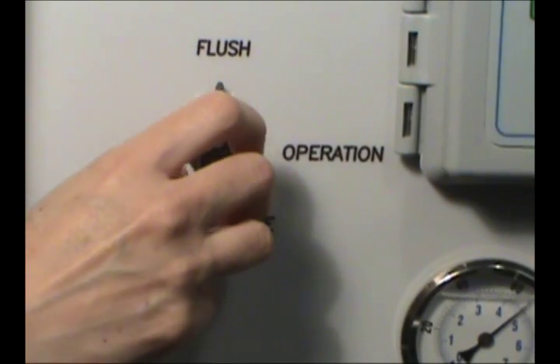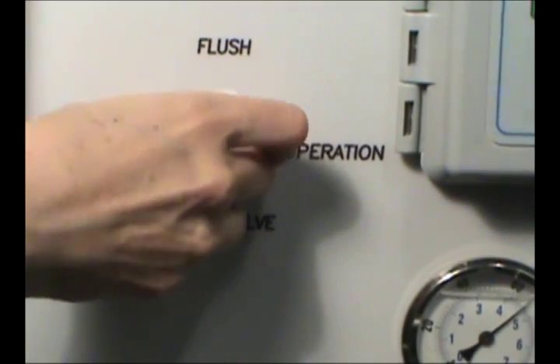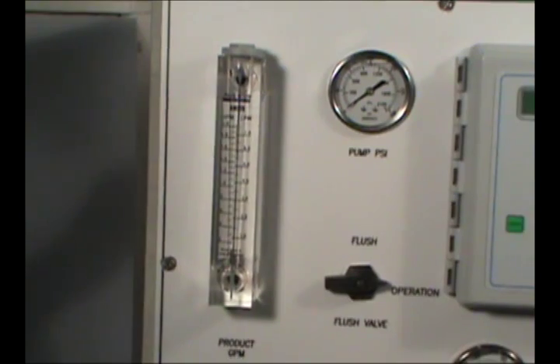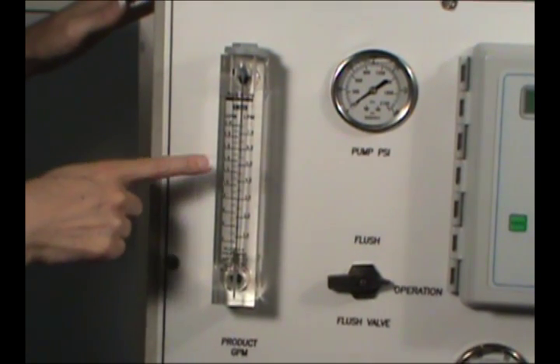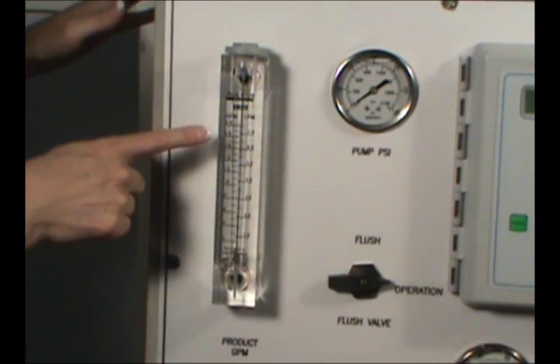After the flushing is complete, turn the flush valve to the operation position. The conductivity level should drop and the flow meter for product water should increase.